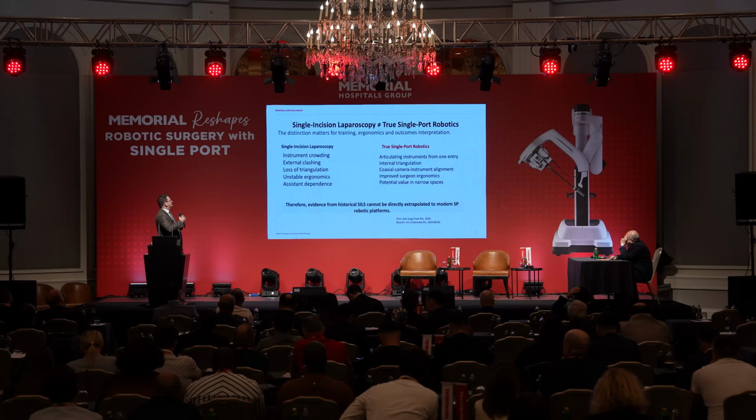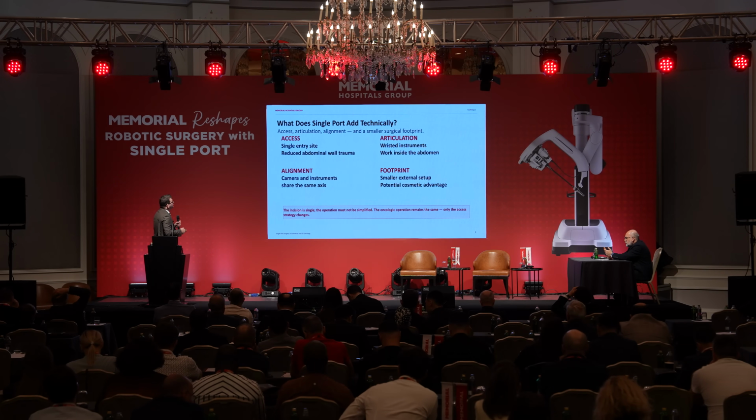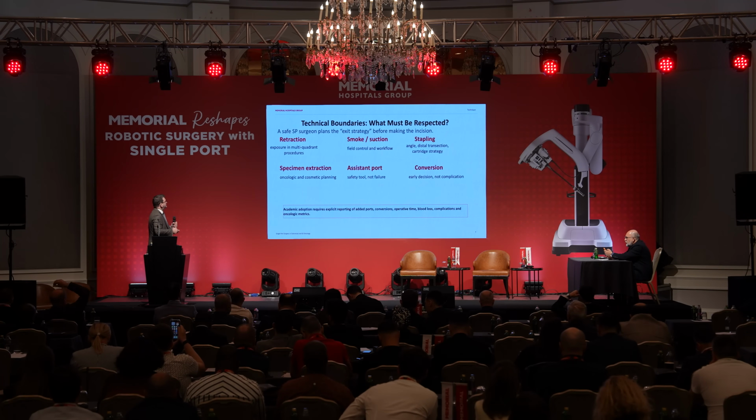Then I'm coming to single incision again. We are not taking this instrument to do appendicectomies, of course. We are taking these instruments to do advanced oncological resection. So it includes all the differences with access, articulation, alignment, and the application of the technique.